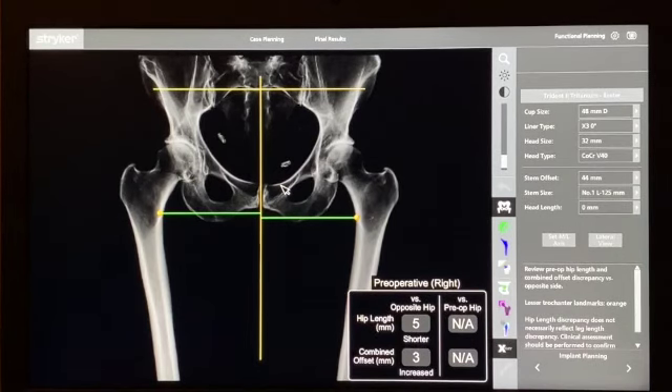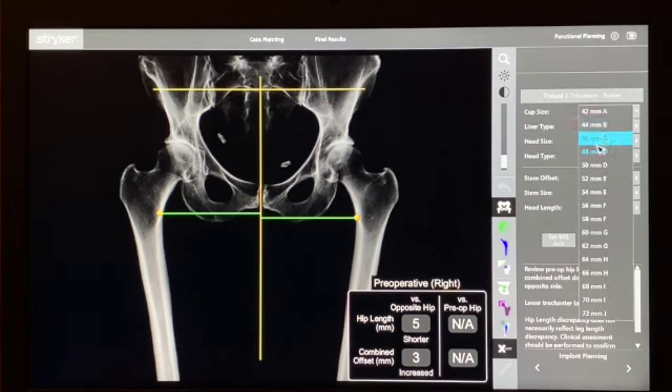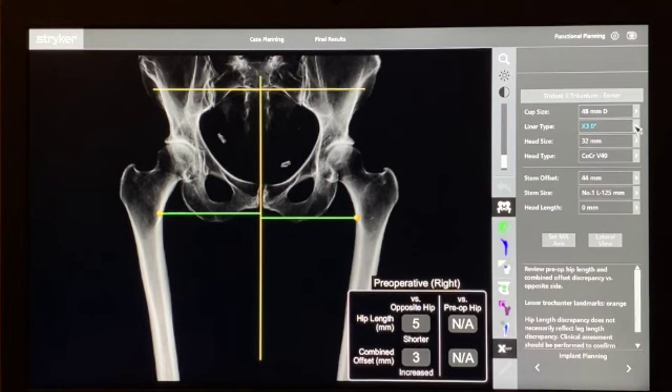Looking at the planning of the hip replacement with the implants, on the right-hand side of the screen we have a listing of cup size, which we can change by scrolling through the drop-down menu. Liner types include the X3, eccentric, dual mobility, or constrained liners. We can also change the head size, head type, stem offset size, and head length — all of which allows us to plan our operation.